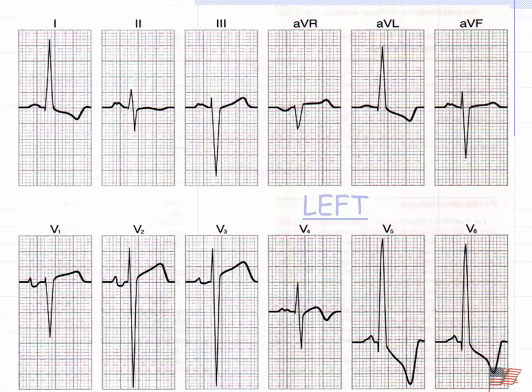So if I combine those two, it says it's going right to left, but it's also going up. So it's got to be in that quadrant.